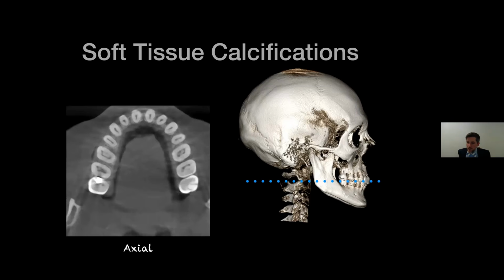Someone said radiology seems to be more limited at the student level, or at least it was in the past. Many say they didn't get as much training as they would have expected at the higher ed level. Do you feel enough time is set aside at the university level for your specialty? Meaning, do dental students get enough education on scan reading, dose technology, or is there room for improvement?